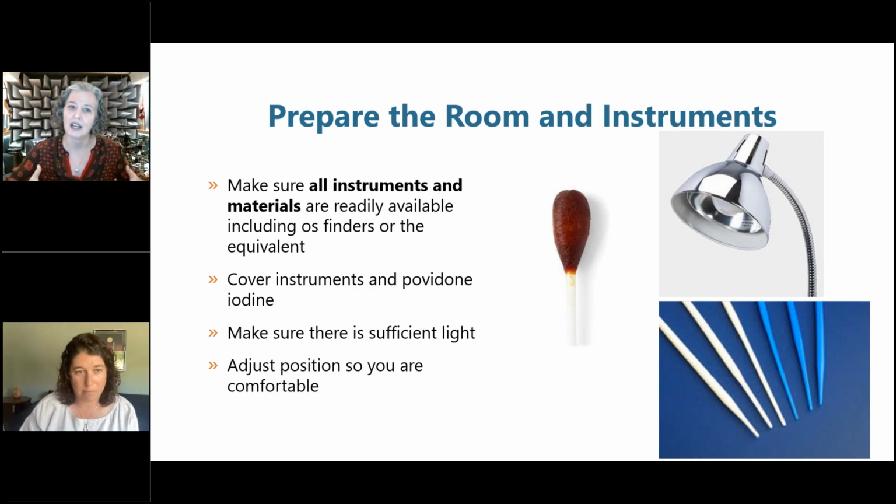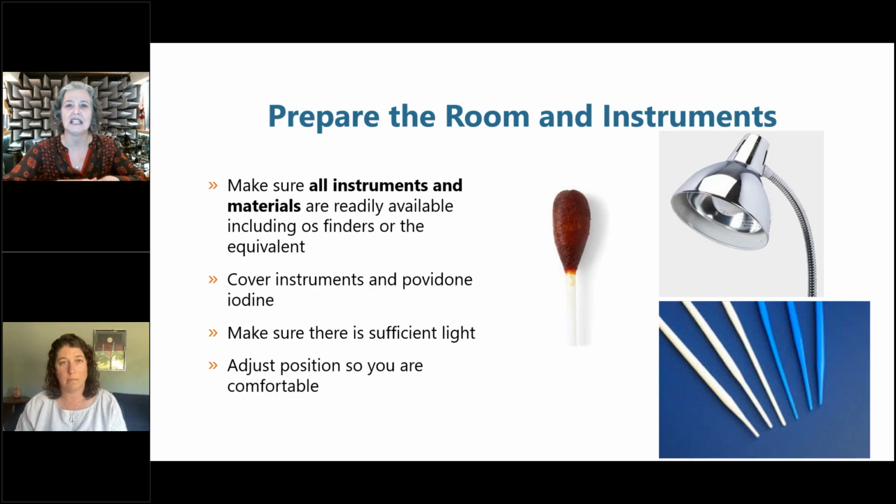So take the time to make sure that every single thing you might need is there at the ready. And also backup for just the basics, the tenaculum and sound, just to have a double kit ready for you. When you are not a medical person, looking at iodine can look like it's old blood, and it can be pretty scary. The tip of a tenaculum can look pretty awful, even to medical people. So any of the things that you're putting out onto the tray that you're going to be using for the placement, cover them with a sterile cover.